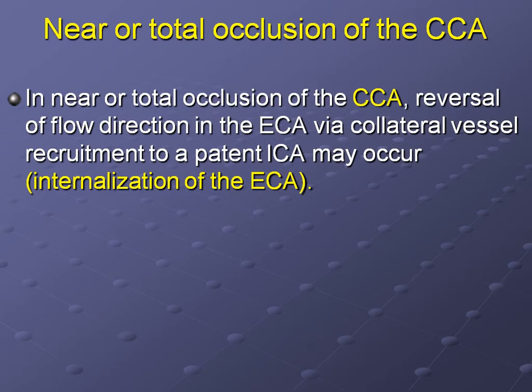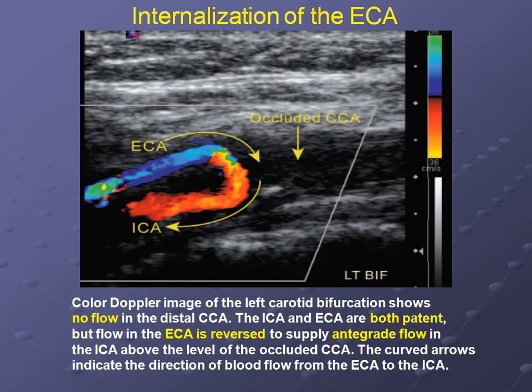حتى يعطي blood supply للبرين. Brain is the most important organ to be supplied with the blood. Okay? يعني, like this. This is the common carotid artery completely occluded. What will happen? The internal مفتوح والإكسترنال مفتوح. The common اللي occluded. The external will steal blood from its branches and shift them to the internal, sorry. Get it? To supply the brain. Where do they get blood, external?